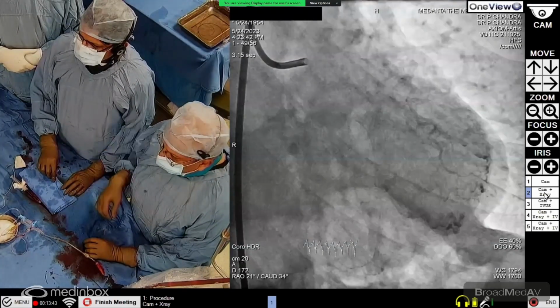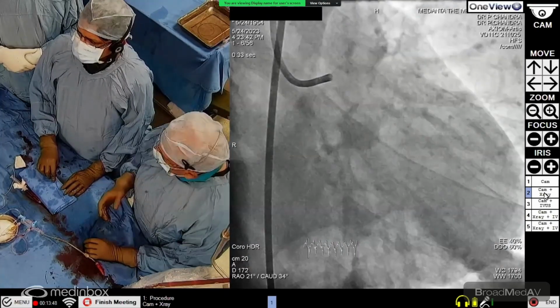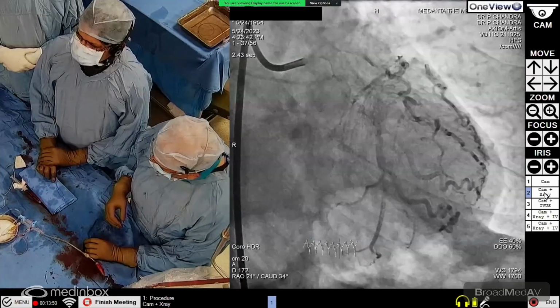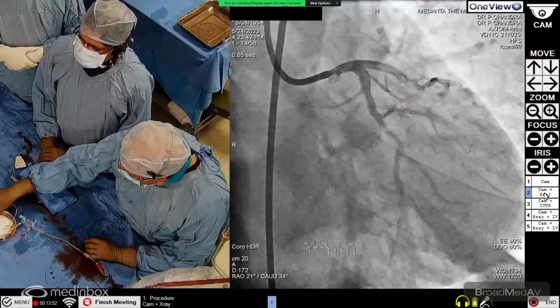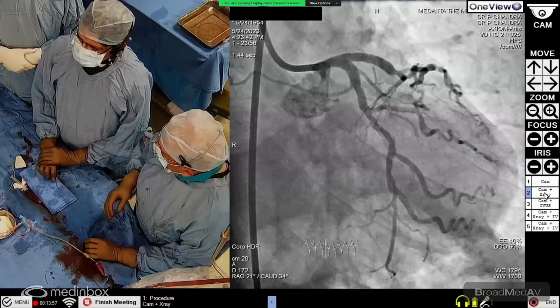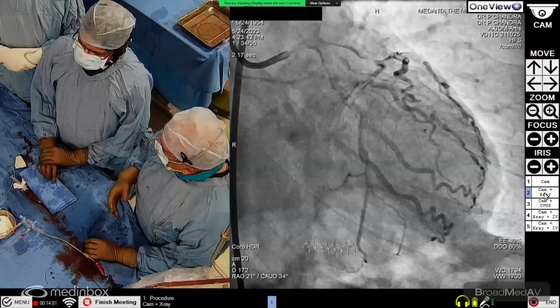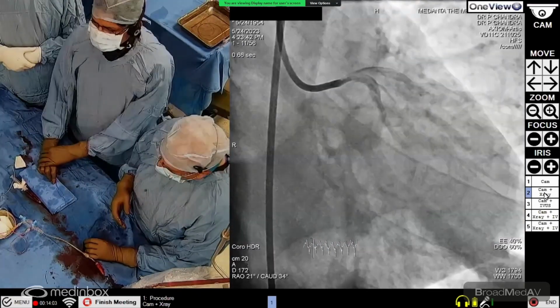Dr. Nagen Chauhan, a senior interventional cardiologist, is going to explain this case and the plan. We want this to be as interesting as possible for everybody, and we will try to give you as much educational value from this case as possible.